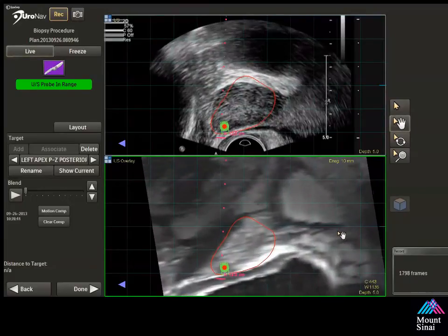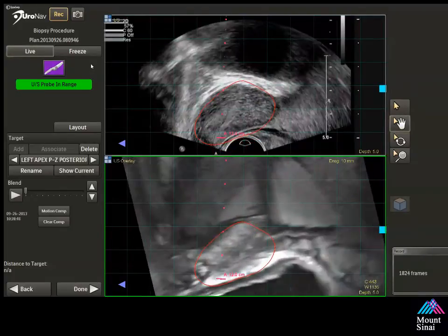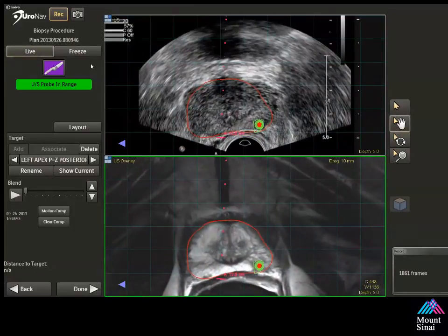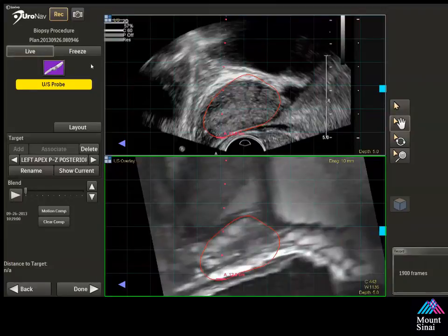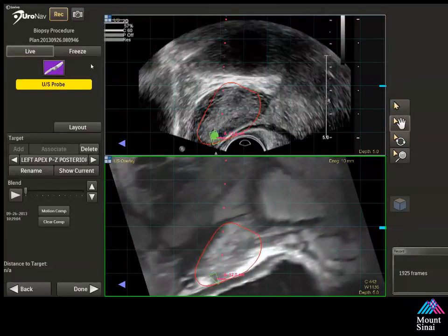We're trying to adjust. My initial segmentation on the MRI, I missed the anterior fibromuscular stroma in some of the views. Therefore, you have to understand that if there is a mistake, you can correct visually, understand that that anterior portion maybe wasn't segmented exactly correct.